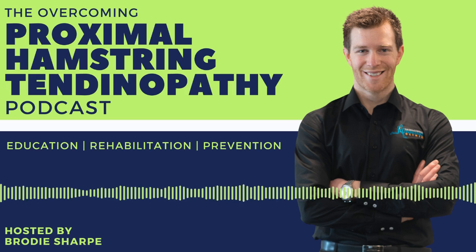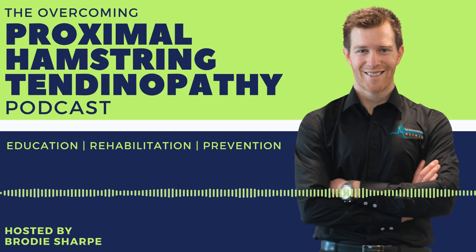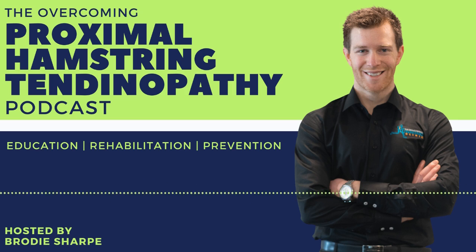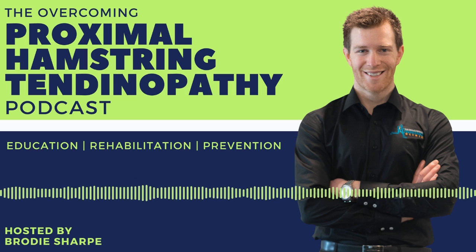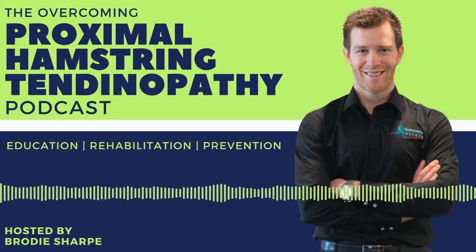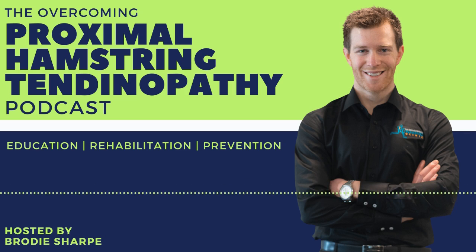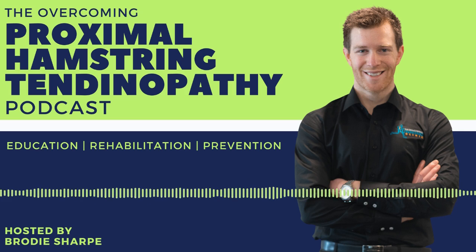The evidence is also quite good in lower limb. If you're somebody like me who has been using it for 8-9 years and teaching for the last 4 years, you would quickly realize that it's very good in lower limb, but I'm not very impressed with the results in upper limb. In tennis elbow and shoulder, it's not something you're going to miss out on, but definitely in lower limb. My top three would be plantar fasciitis, Achilles, and lateral hip pain. Those three, I think you're going to have a good result. It doesn't work equally for everything. Every tendon is different. Tennis elbow is different from Achilles.